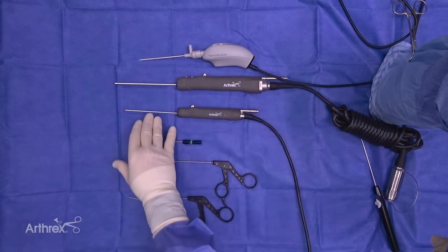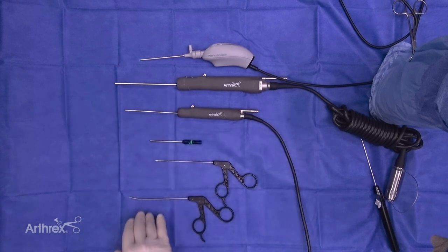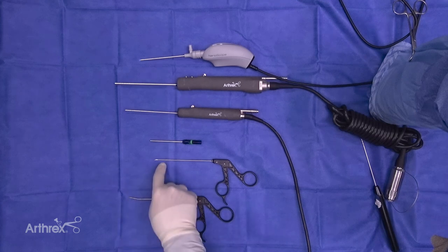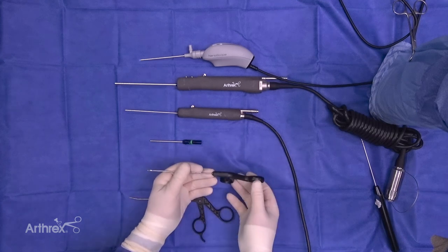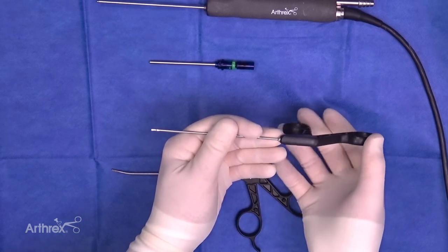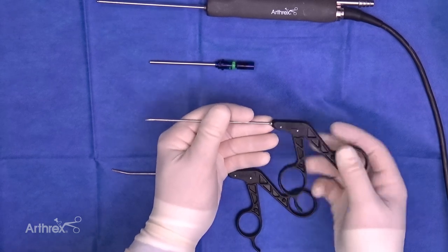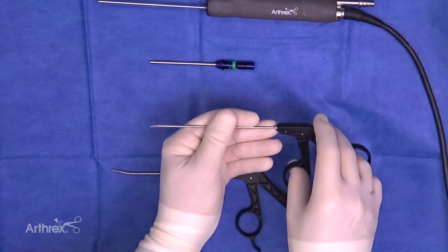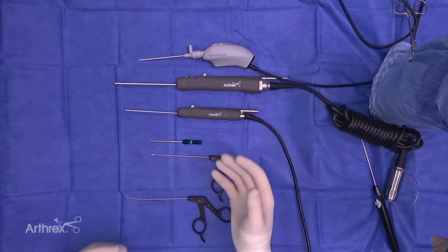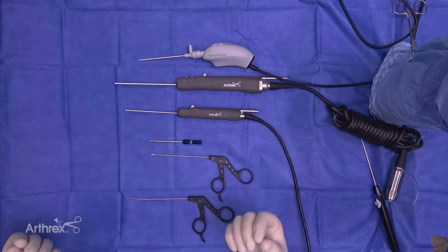The other thing I want to highlight is how well this pairs with the Nano biters. You've got our up-angle biter and our straight biter, and you can see these resect a smaller diameter of tissue compared to a standard biter. With this smaller diameter biter, it pairs very well with this smaller diameter shaver, so we can very easily remove those resected fragments when we're doing Nano Arthroscopy.